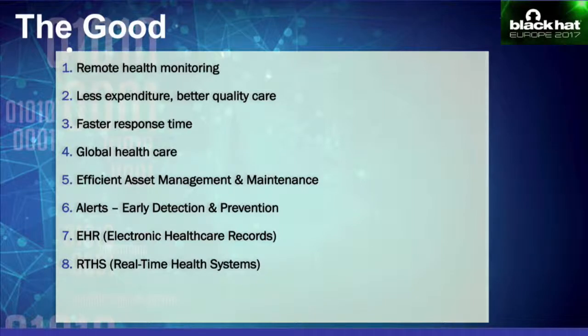And so EHRs are not as powerful. They were never meant to gather data in real time. They were never meant to interact too much with the connected IoT devices. But RTHS is very powerful. It provides very powerful data analytics. And so, again, it takes all this real-time data, which can really be used by a lot of researchers in discerning patterns. They can be used by device manufacturers to see how the devices are functioning, and then use that data for the betterment of the device.